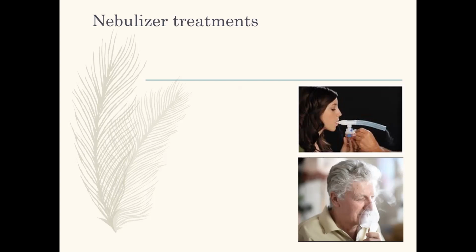Whichever way, we just want to make sure that when the aerosolized medication starts, we've got it on one way or the other. If they are using the mouthpiece, they need to secure it with their teeth and seal it with their lips. We want to tell our clients to inhale slowly and deeply through their mouth. We'll continue until all the medication is aerosolized and the cup is empty. So that's how you know you're done.